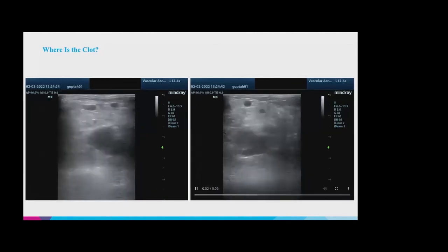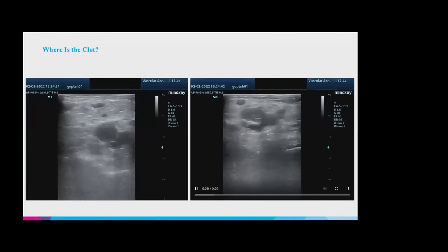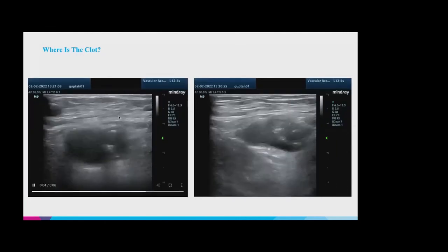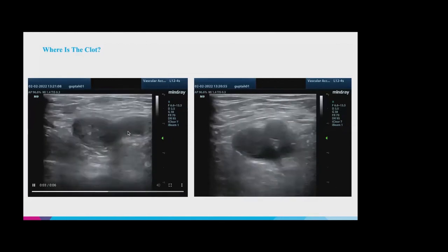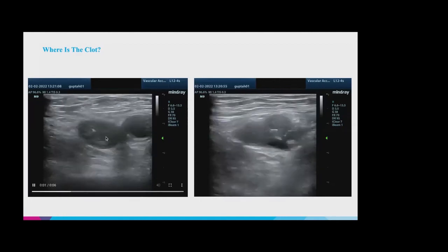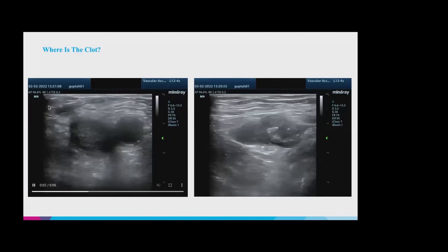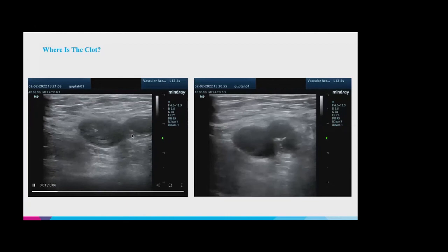And then I think I have maybe one final example. Sorry, Dr. Rothman, can you repeat the rationale why you know that it's on the left side? Yeah, so if we're assuming proper technique, right, you see how the artery is to the right of the screen. On the patient's body, the artery should always be lateral to the vein. So if the dot is pointing to the patient's right, that means the left of the screen is medial and the right of the screen is lateral. Oh yeah, okay, got it. Thank you. Yep.